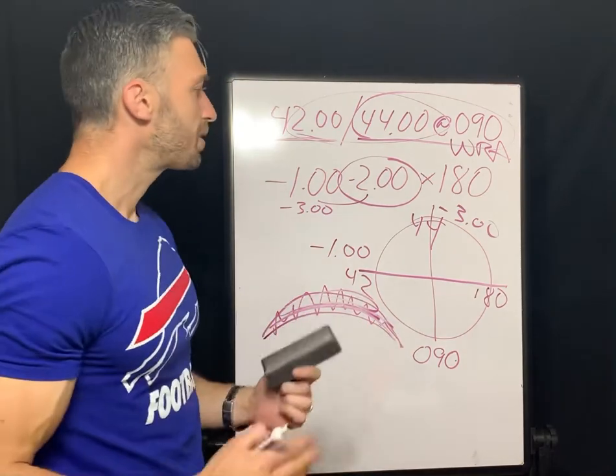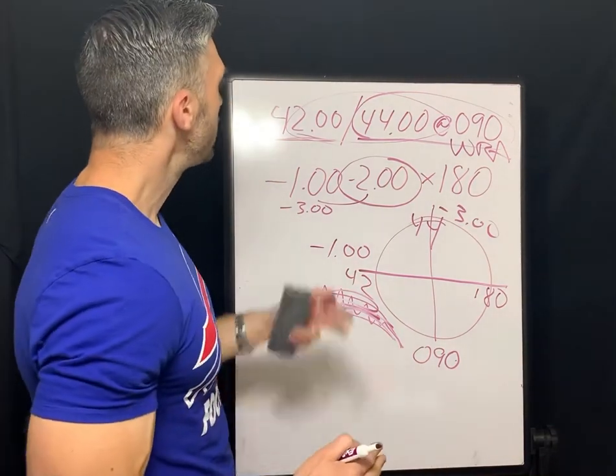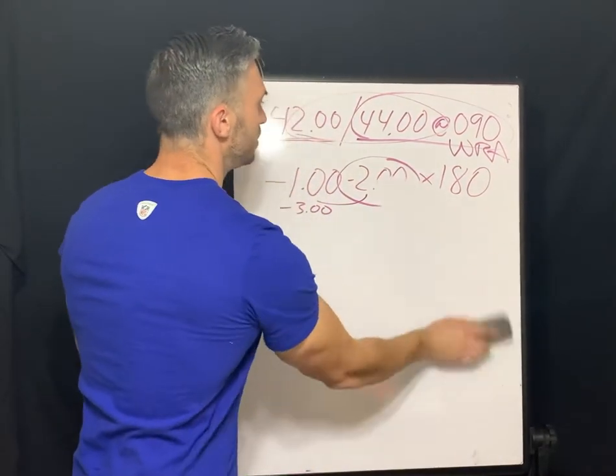So it can correct for that. So actually with this example, we could use a spherical gas permeable lens. There's nothing abnormal about it. Our Ks match our refractive cylinder. I'm going to go ahead and erase this example.